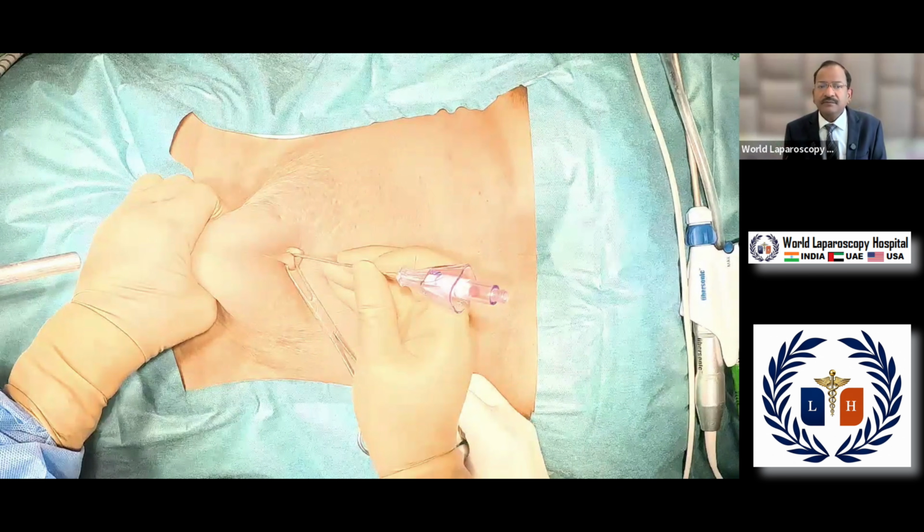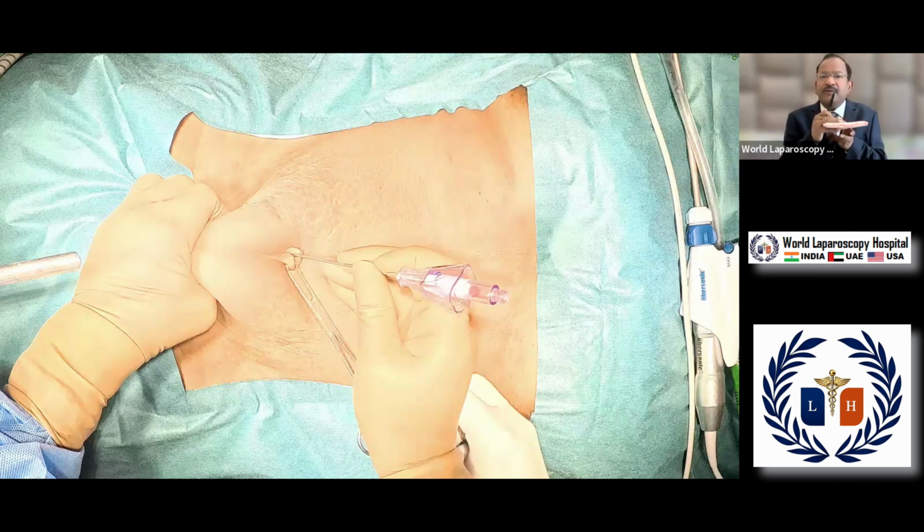But remember, with the abdominal wall, your angle is 90 degree. And with the body, your angle is 45 degree. So, you have to lift the abdominal wall in such a way that angle between the Veress needle and abdominal wall is 90 degree. And angle between the Veress needle and the body of the patient is 45 degree. Without lifting, if you will try to go perpendicular, there is a chance that you can injure the bowel, you can injure the vessel.